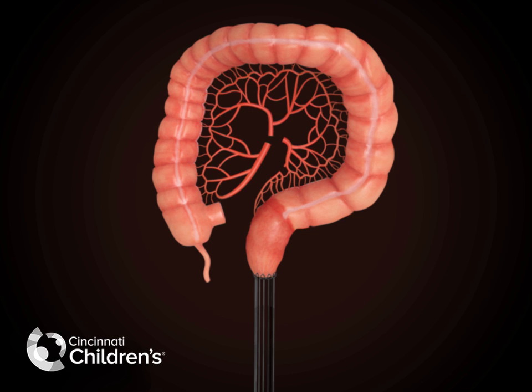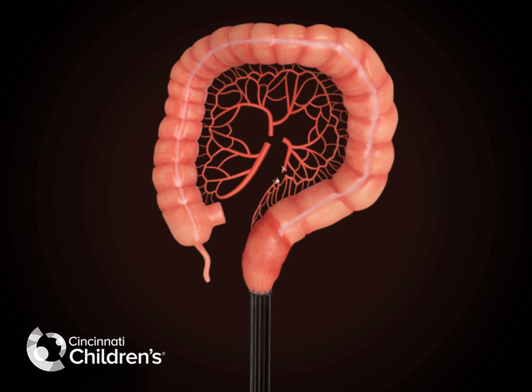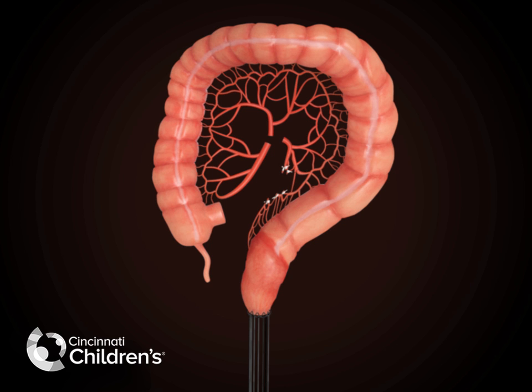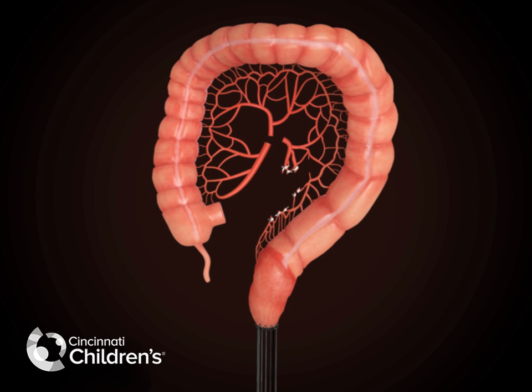The mesenteric arcade supplying the bowel is carefully examined and branches serially divided, maintaining the main arterial supply to the bowel but releasing the smaller branches that will allow the bowel to be brought easily down to the perineum.